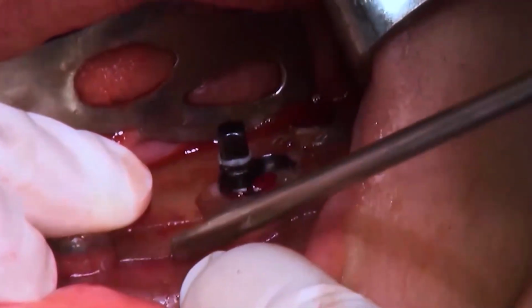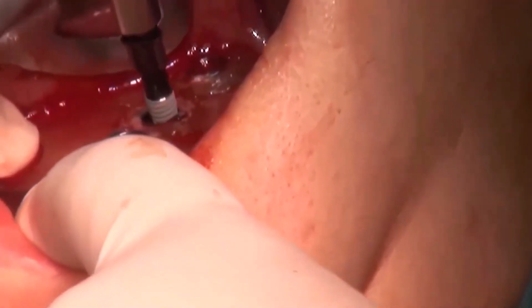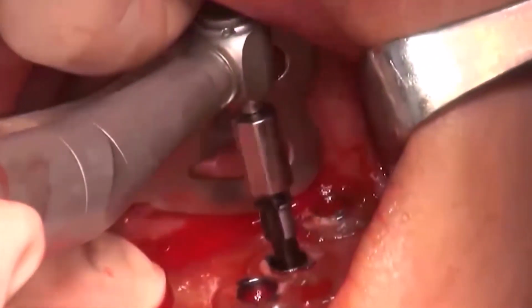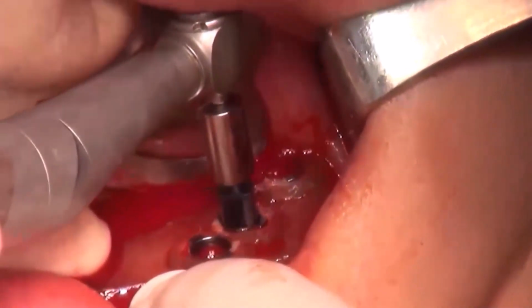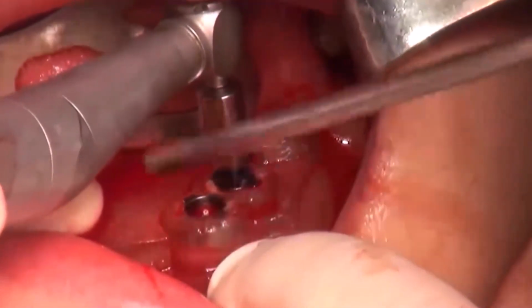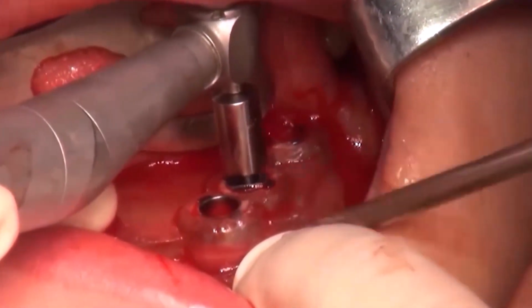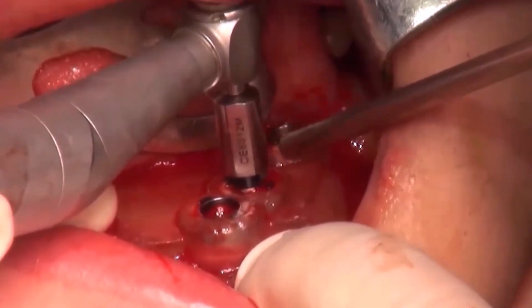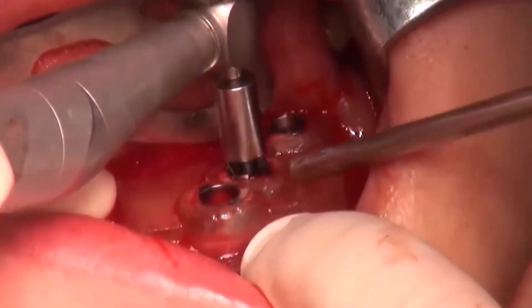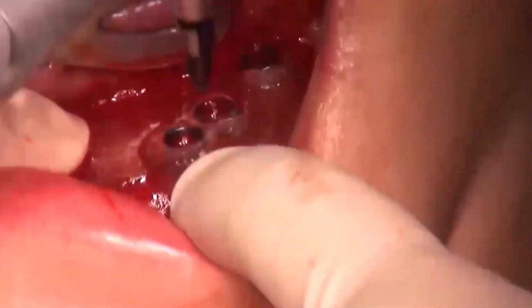I got a strong initial implant stability of this implant as well. This implant as well, I got a strong initial implant stability.